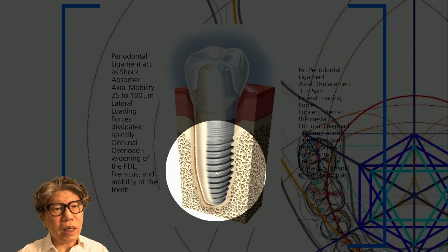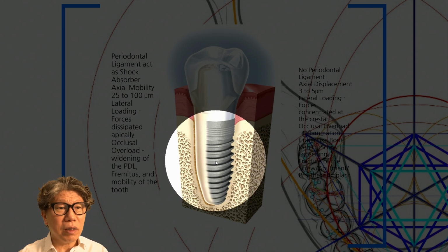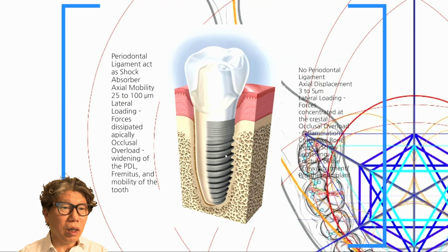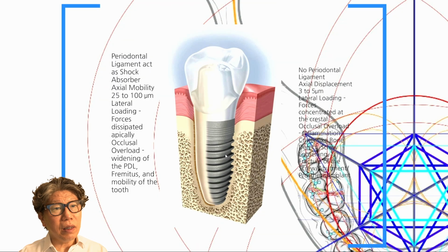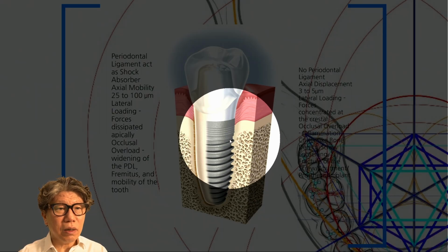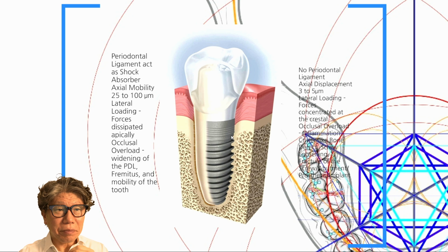If you were to choose a material that doesn't rust other than titanium, eventually you might include an HA coating. In HA coating, hydroxyapatite does not rust because it's not metal. Therefore, HA-coated implants are also able to regenerate bone tissue very closely to the implant surface.